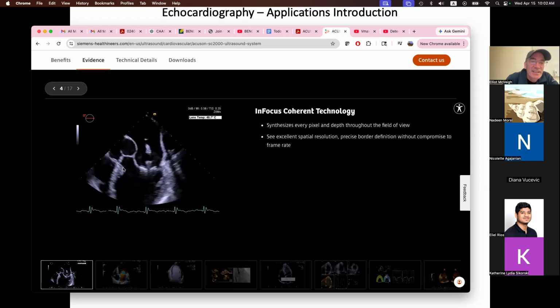And so, yeah, you can see that there's an extra blur all over here, and that's that depth in the signal to noise and spatial resolution. That probably the optimal spatial resolution is right about here in both the slice direction and in the lateral direction. And this is a gorgeous picture of the aorta, right? And the aortic valve opening and closing nicely.